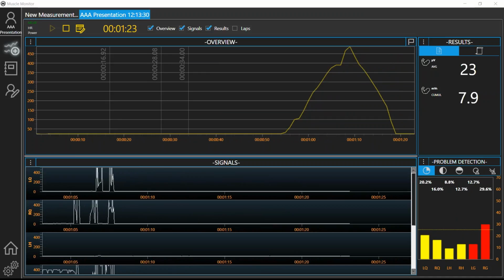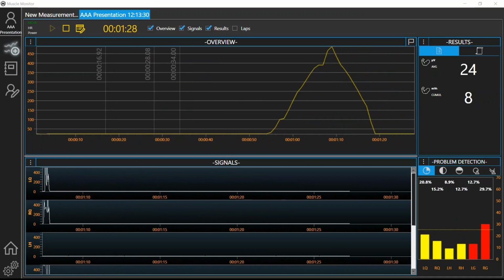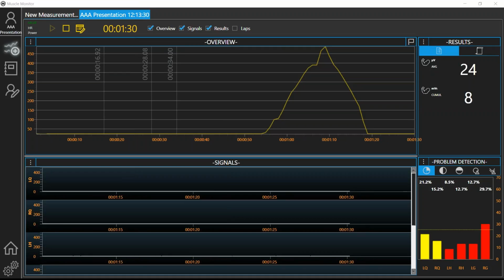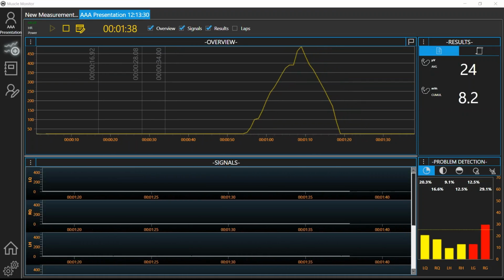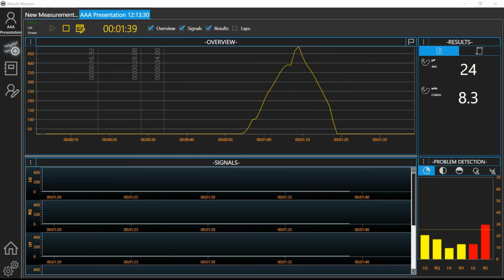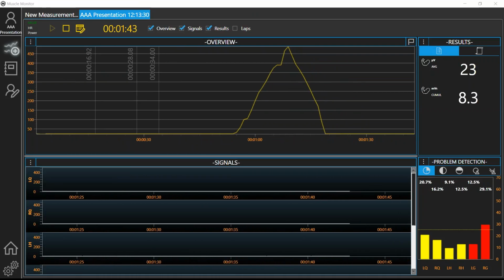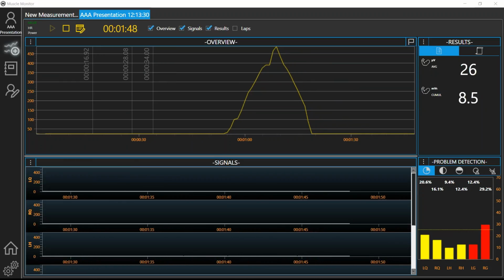What are the key requirements? Yes, they are actually in the user guide that will be attached with the software. I wonder if I can quickly look them up.